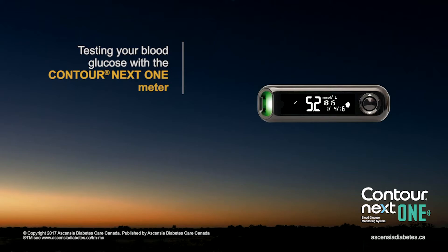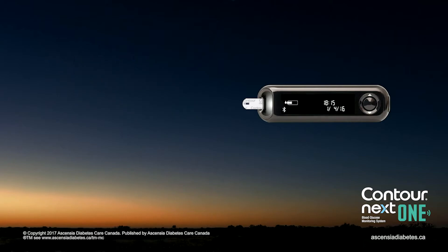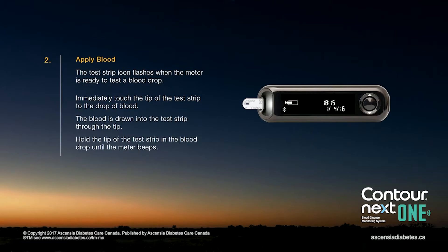Testing your blood glucose with the Contour Next One Meter. Hold the test strip with the grey square end facing toward the meter. Insert the grey square end firmly into the test strip port until the meter beeps. The test strip icon flashes when the meter is ready to test a blood drop.